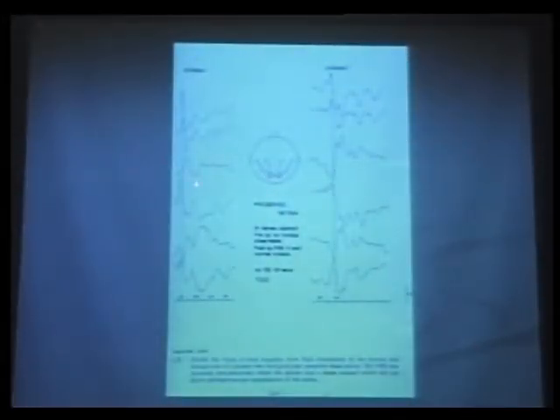And the reason is here's a flash VEP, and this is showing you different areas of the brain that it is being projected over. And so your flash VEP is represented so diffusely in the brain, whether it be temporal, parietal, or deep white matter, that anywhere that is transmitted to will show up as a positive flash response. It doesn't take occipital cortical integrity to show a normal flash VEP response.